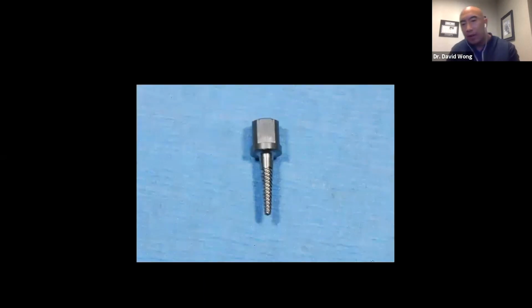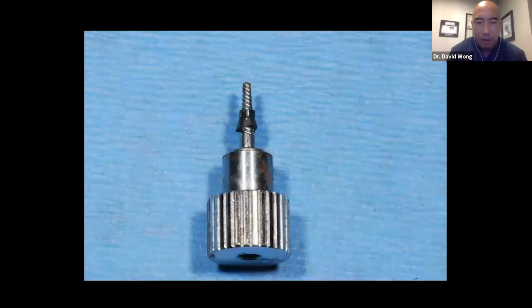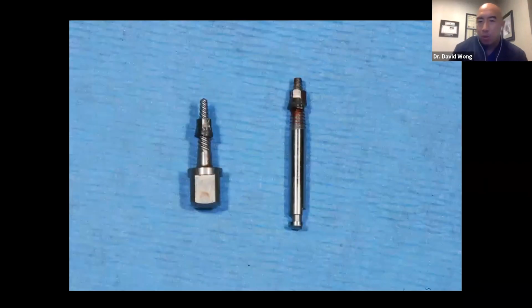So now we have another instrument that goes into either a handpiece or a torque wrench. You'll notice that it's got a few little threads on it. What we do is thread it gently into the remaining fractured abutment piece. And then you simply just pull, yank it out, wiggle it and pull it out. And that's what we did here.